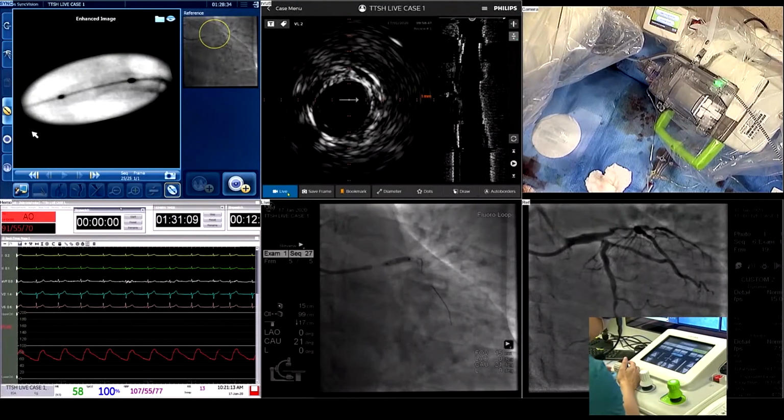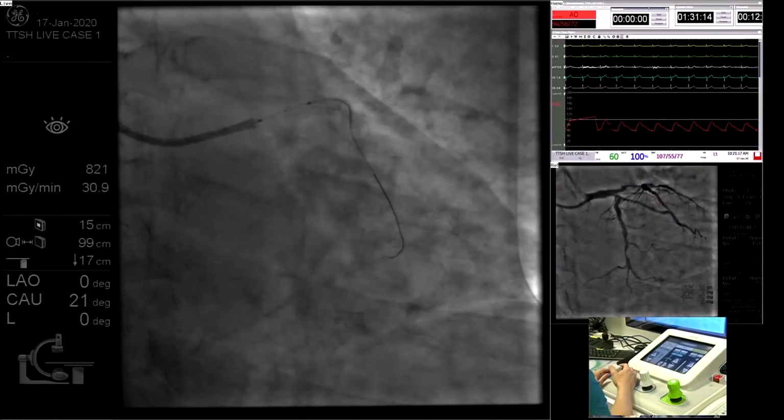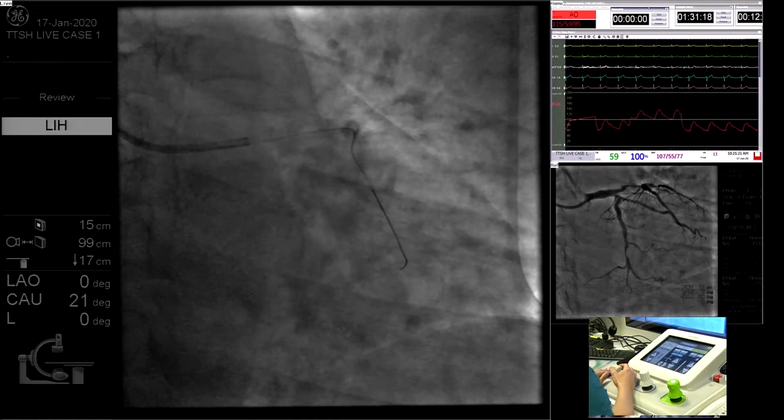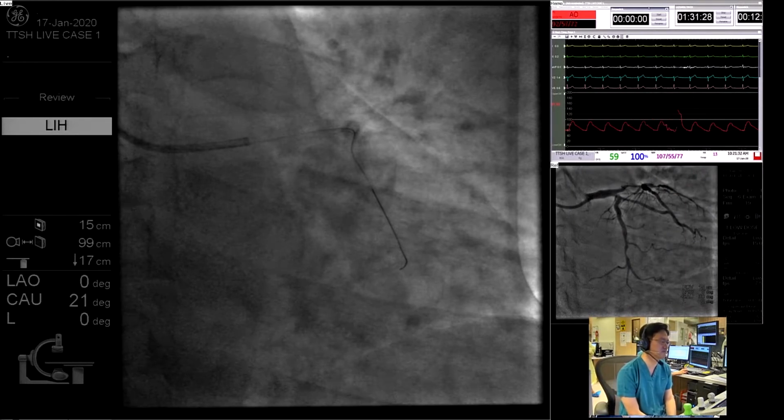Okay, so can we load back the IVUS system and have a look? Yes, please. Rolando, can you go back to AP cranial?